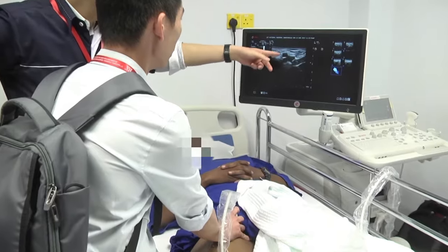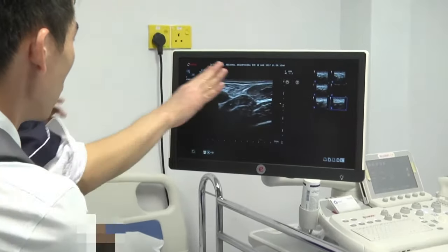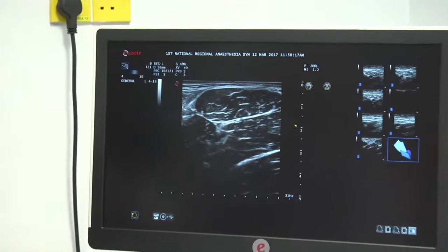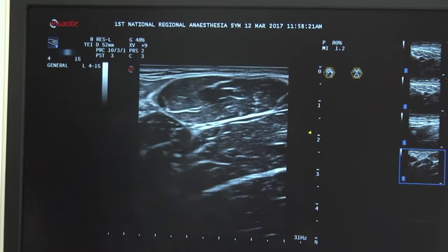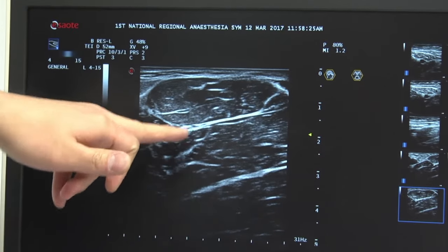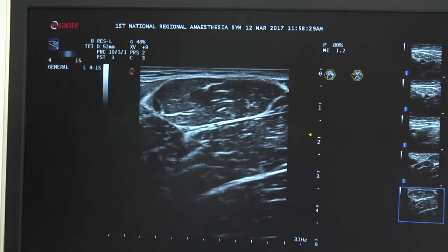Yeah, femoral artery. And yeah, more medial. You're here. Yeah, three layers and two planes. The plane for the anterior branch and the plane for the posterior branch of the obturator nerve. Yeah, right.